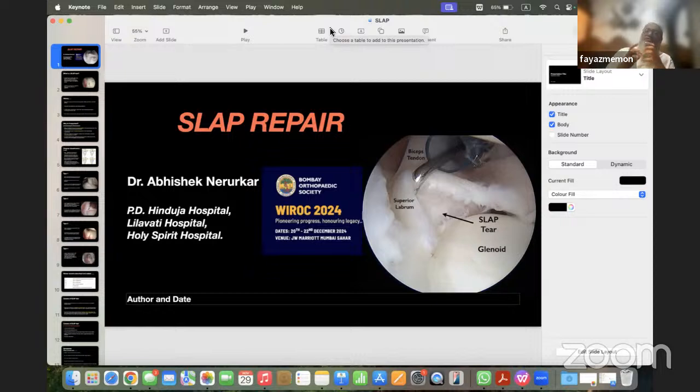So it is the question of suture management basically. When you're sliding one knot, keep the other ones separate, and then you do it. And you have to visualize that the knot goes. Otherwise, it is just those knots, and it is not the healing of the capsule to the bone. So that you need to remember. So it's all about suture management.